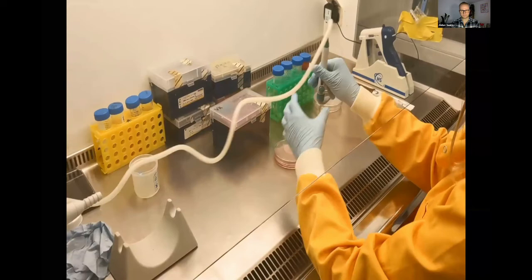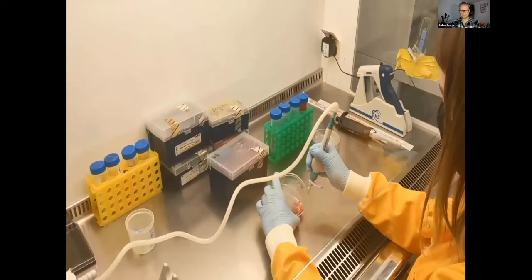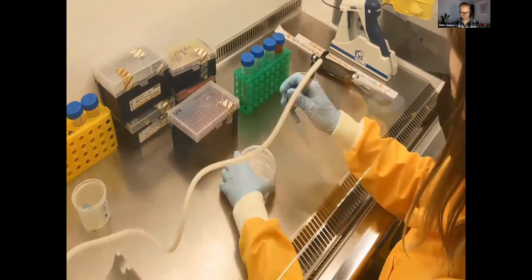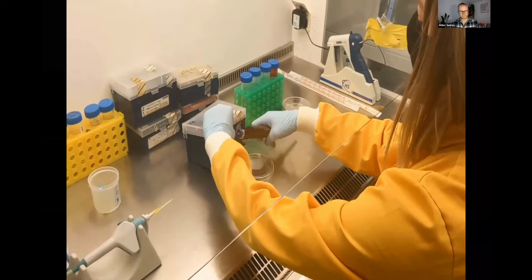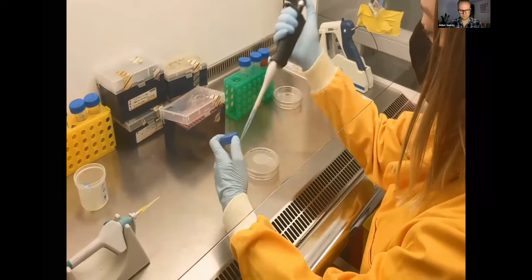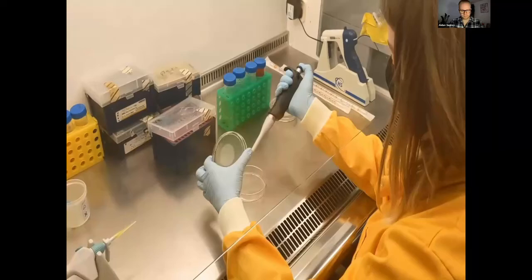The researcher begins by removing the old growth media. This does not remove the cells, as they are stuck down to the surface of the plate. Old media needs to be removed, as it contains many waste products from the cells. Next, the cells are washed with phosphate-buffered saline solution to remove waste and old media.